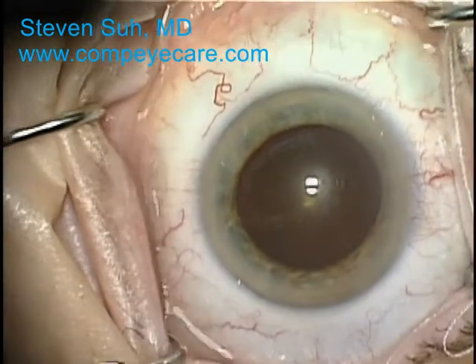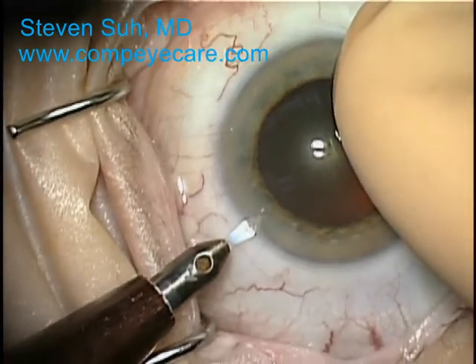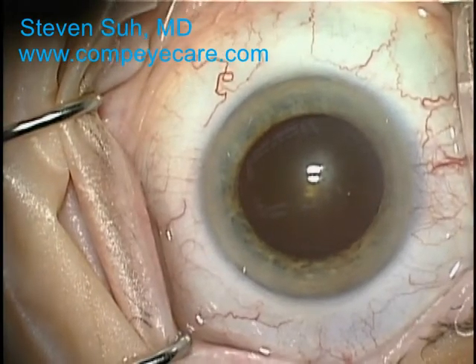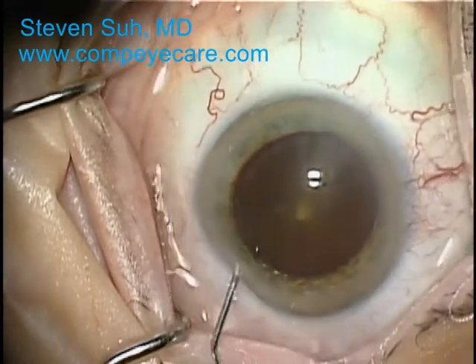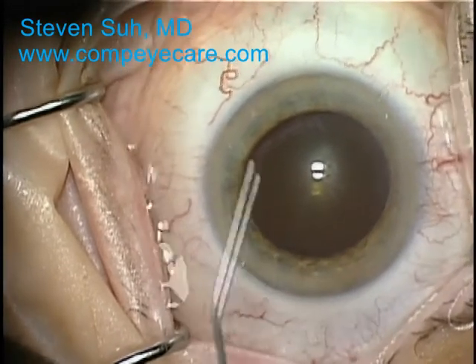The surgery begins with the first of 2 incisions. This one is called a paracentesis, or side port incision, and is about 1 millimeter in width. Since we use topical anesthesia in this case, I am now injecting some lidocaine into the eye to help minimize the patient's discomfort during the surgery.